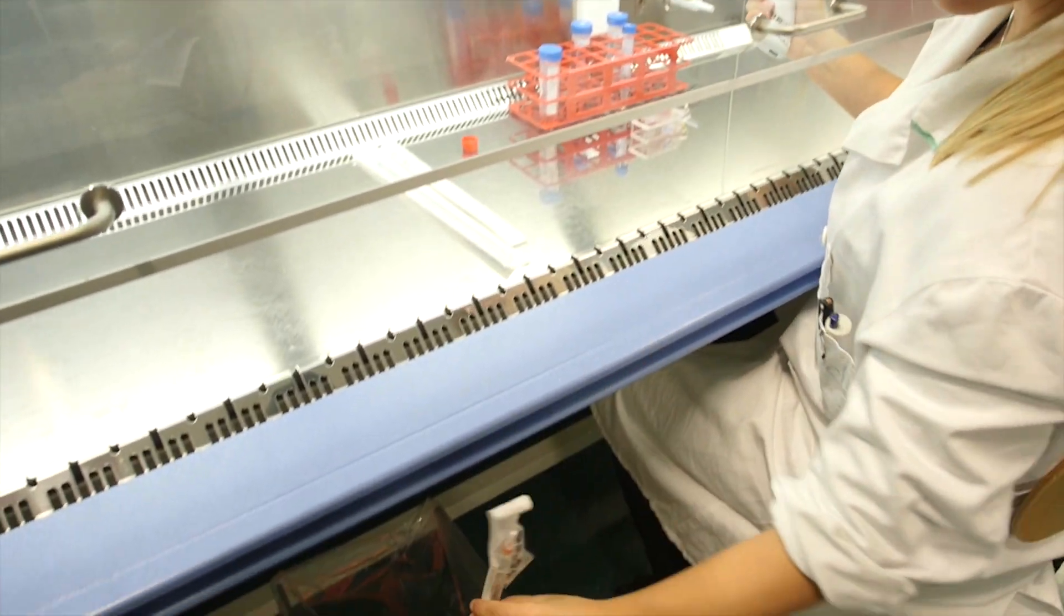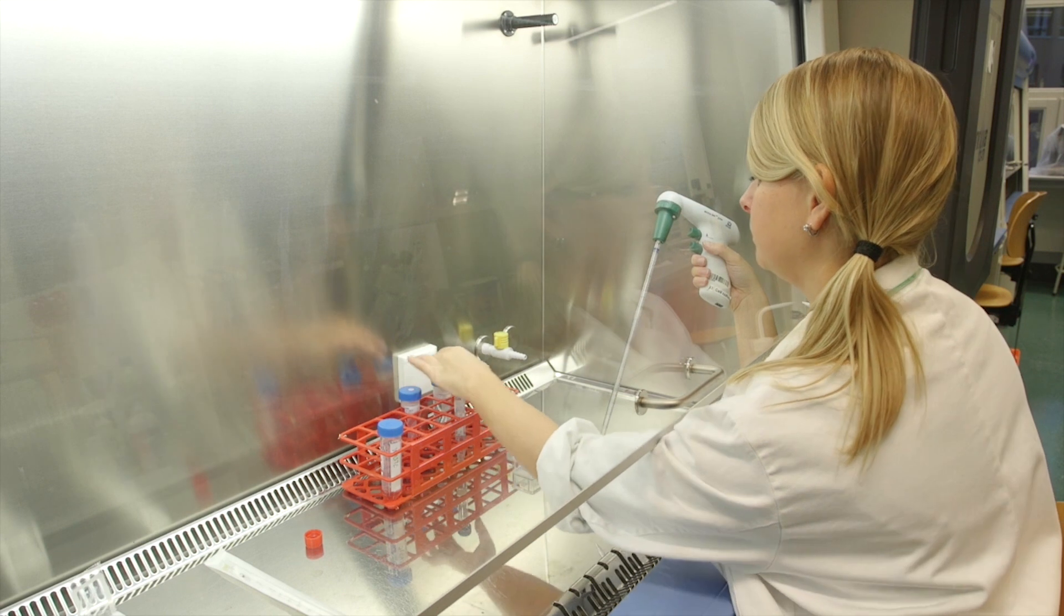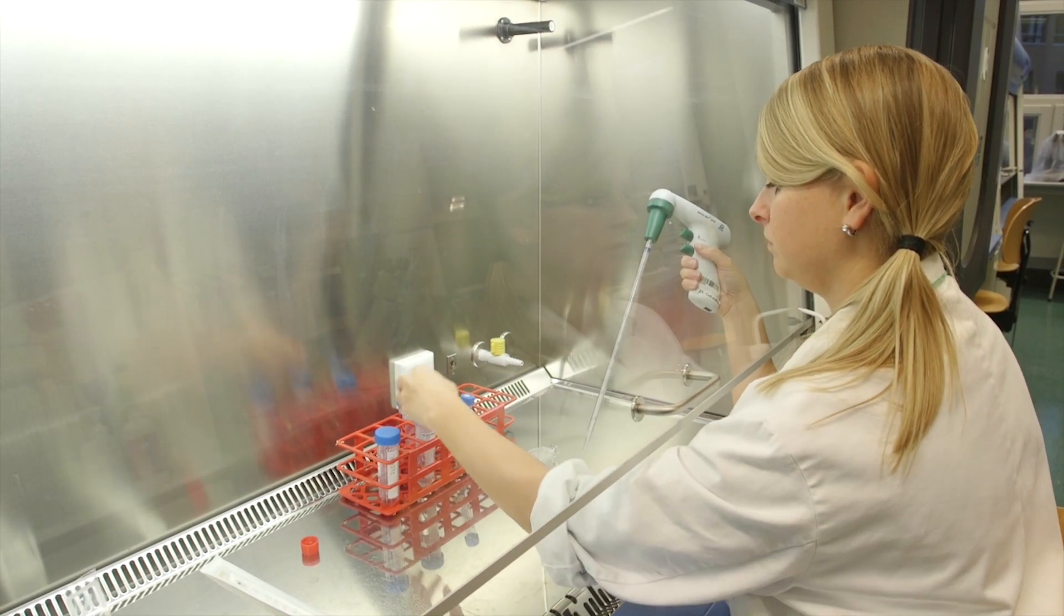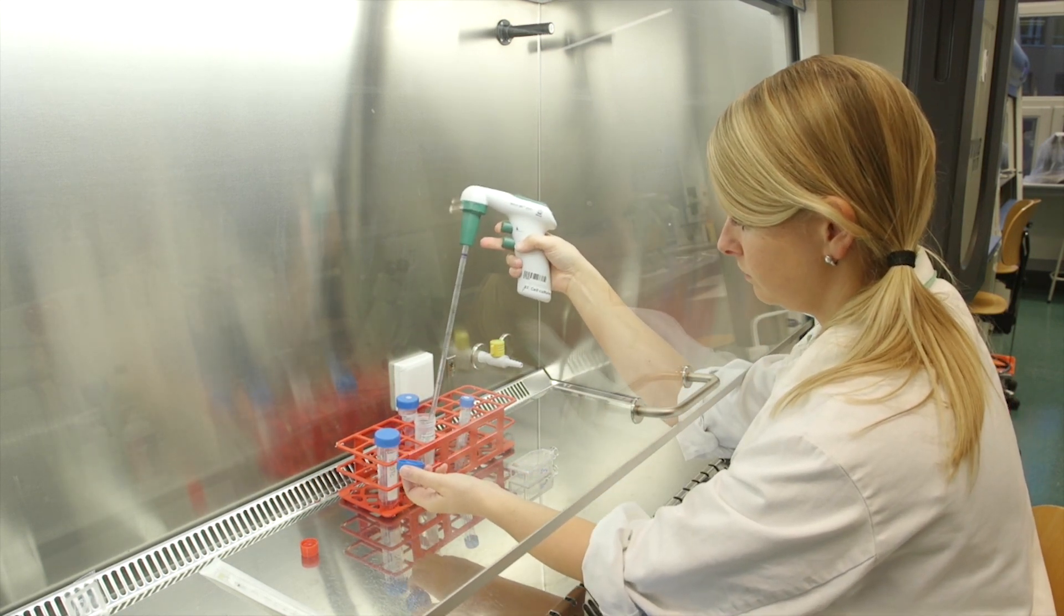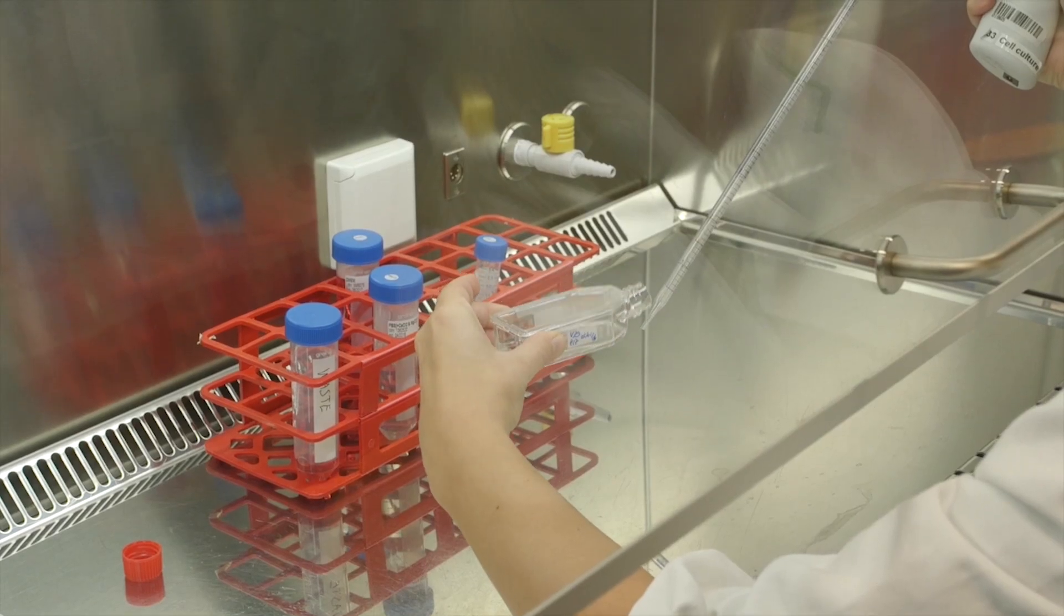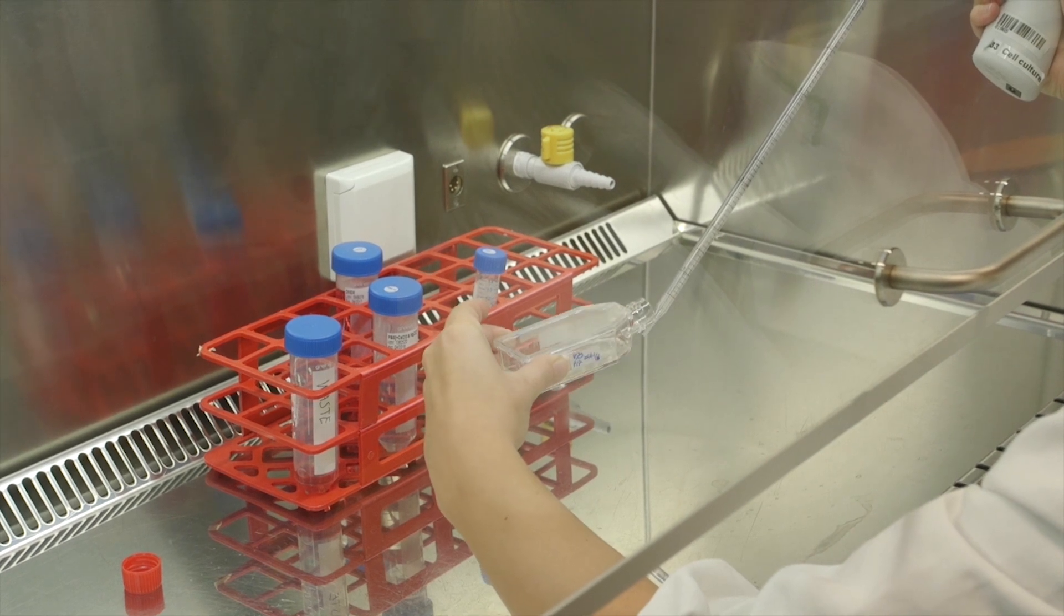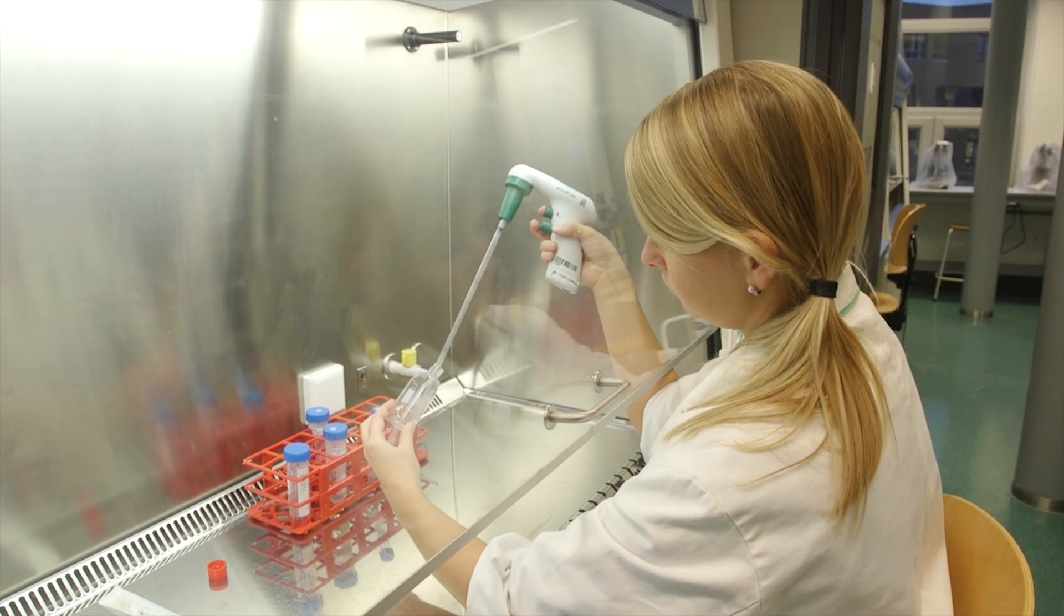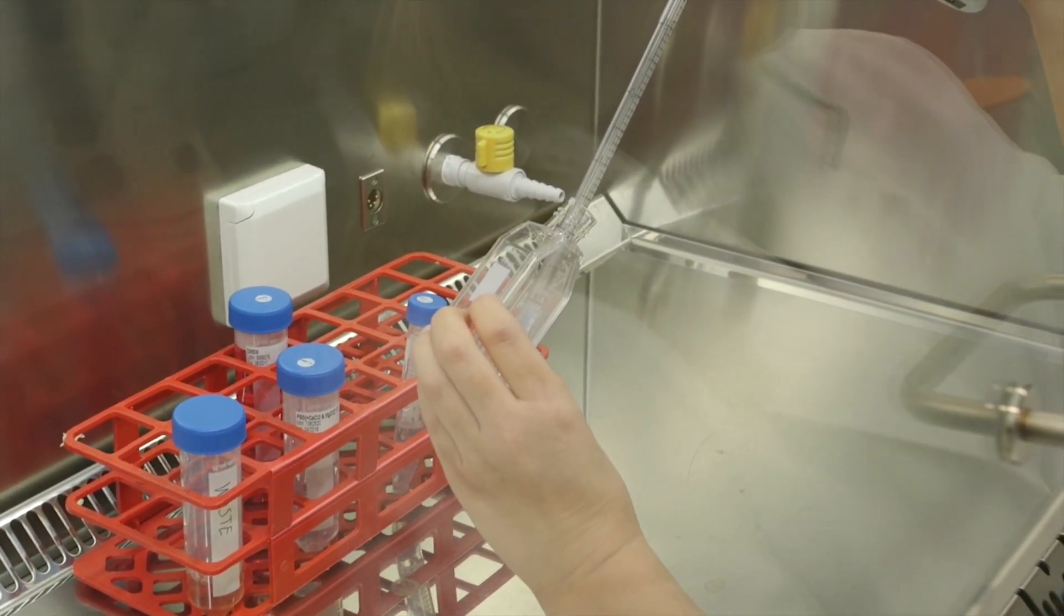The cells are now dry as they are not covered with medium, which is not good for the cells. Therefore, move on quickly to washing with PBS. Fill a pipette with 5 ml of PBS and pipette this to the bottom of the culture flask. Tilt the flask gently so the PBS covers and washes the cells. Using the same pipette, the PBS can be aspirated from the corner. This step is then repeated with a new stripette and fresh PBS.